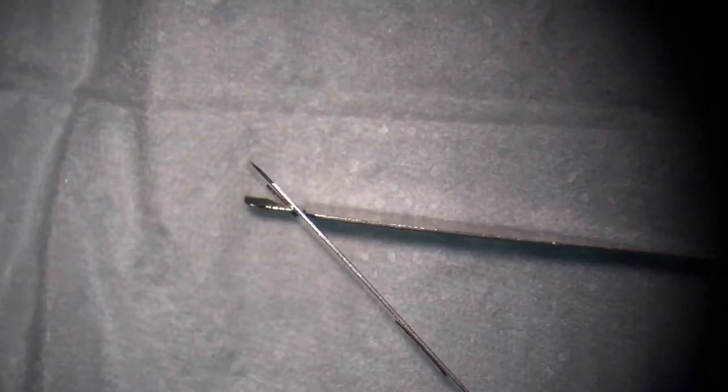So another thing is this is the flat handle. Versus this, the round handle. That's the difference. With the round handle, one of the advantages is you can turn it easier. With the flat handle, you can hold it more stable. It's not so easy to slip away from your hand.